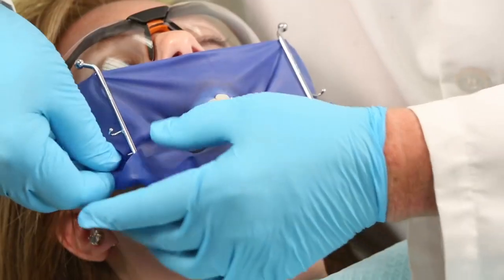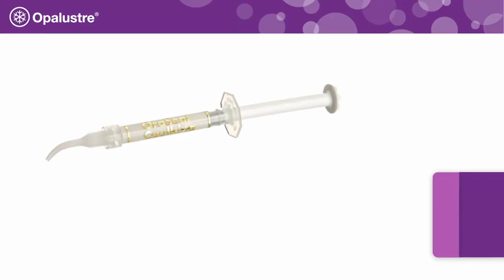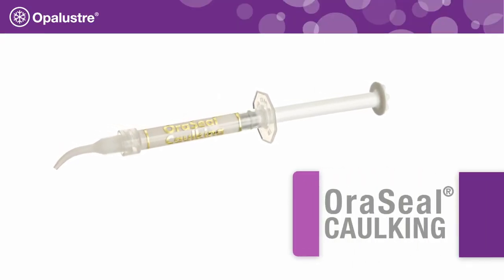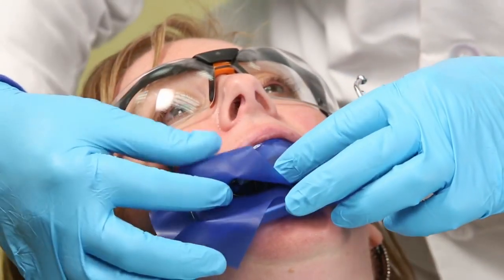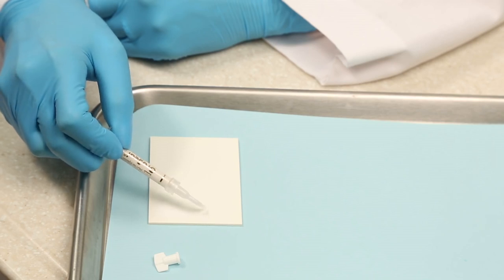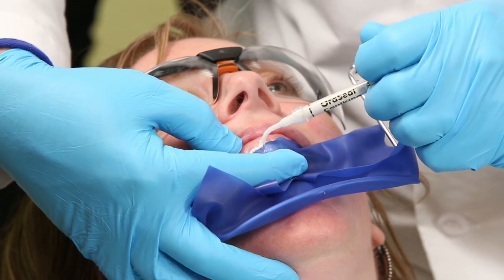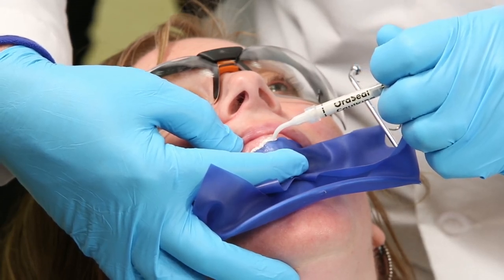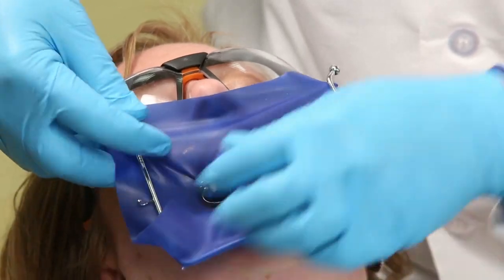Apply the rubber dam attaching to the frame and inverting the dam at the gingival border. For additional protection, use OraSeal caulking to prevent tissue damage. Simply peel back the rubber dam to expose the tissue. Express a small amount on a pad first to check flow, then express a thin ribbon of OraSeal caulking beneath the rubber dam along the gingival margin to prevent leakage. Reattach the rubber dam to the frame and re-invert the rubber dam where needed.